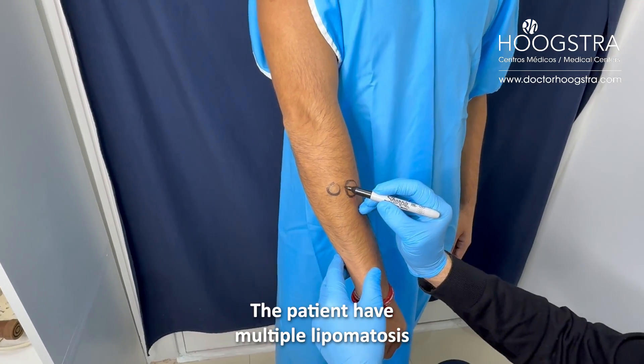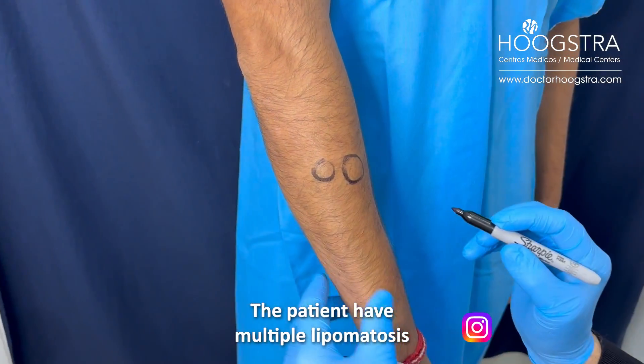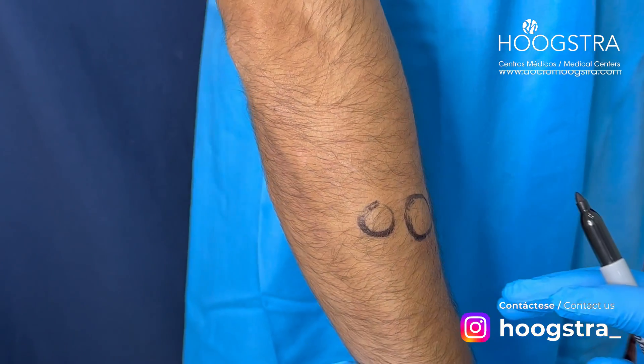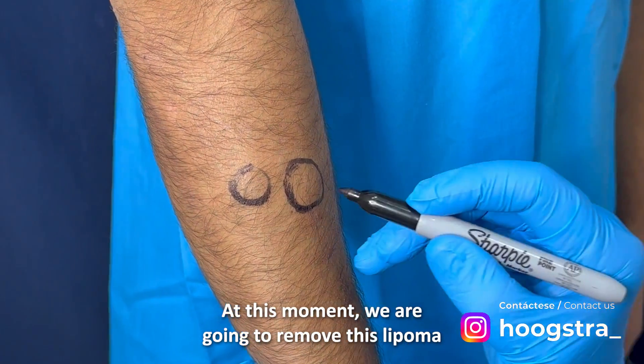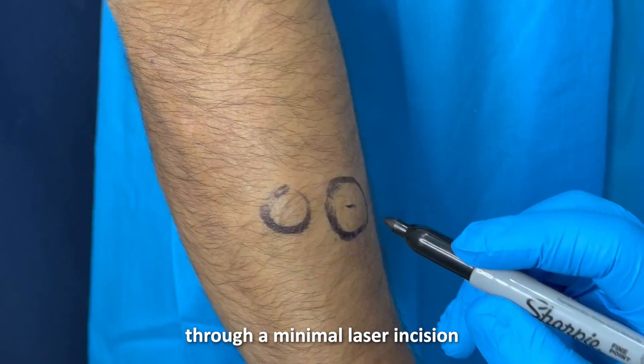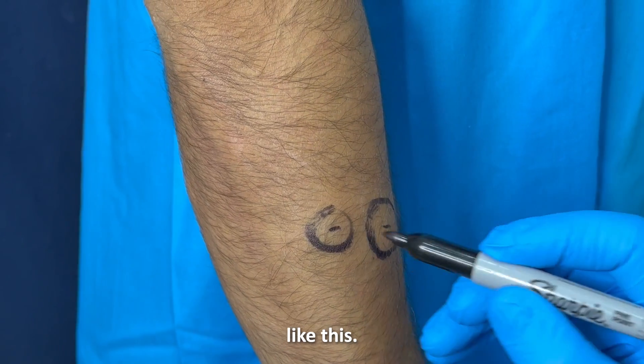The patient has multiple lipomatosis. The lipomas are all around the body. At this moment, we are going to remove this lipoma through a minimal laser incision, like this.